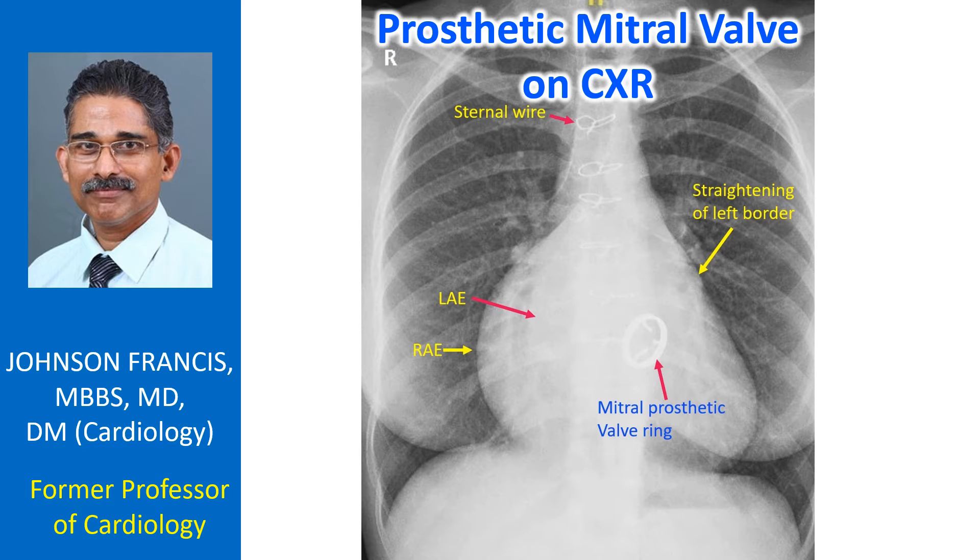Left atrial enlargement is seen as a double density on the right side and straightening of the left border on the left side. Sternal wires indicate a post-sternotomy state.